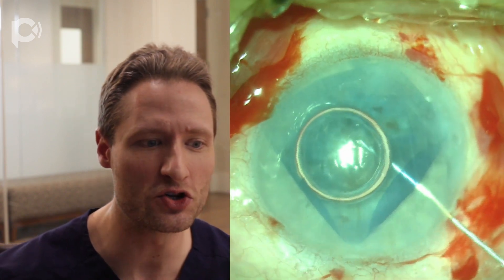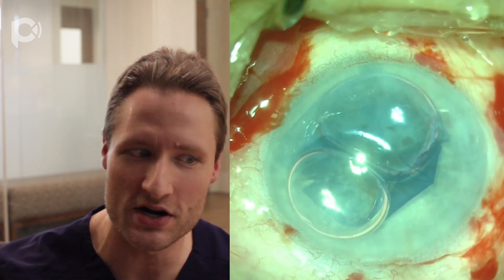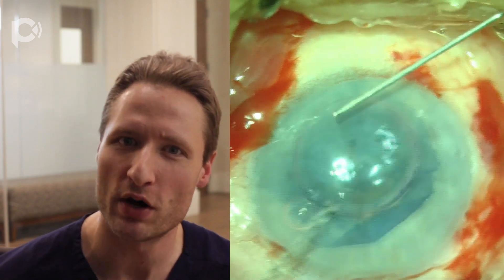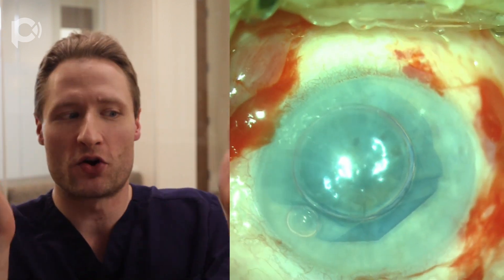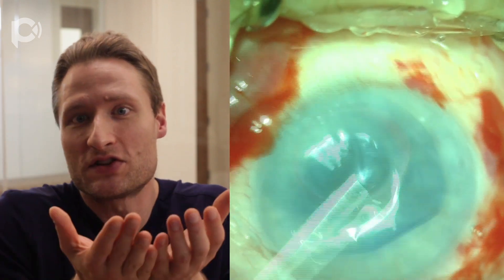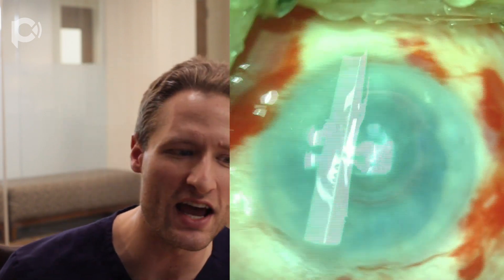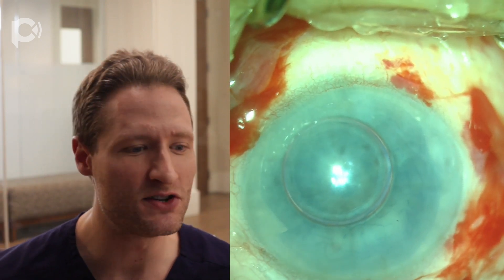The problem was the graft was de-centered when the bubble was put in. Now I have the graft largely unfolded with the air bubble, but if you remove the bubble, the graft will curl right back up. So what you do is put a second bubble underneath the graft — and you see now there are two bubbles in the eye, one underneath the graft and one on top. This is the double bubble. You then remove the bubble from on top of the graft. This is how you lift a graft up to the posterior corneal surface: use a bubble on top to pin the graft open, then put a second bubble underneath to lift the graft up. As the graft lifts, the top bubble shifts off to the side and you can aspirate and remove it.